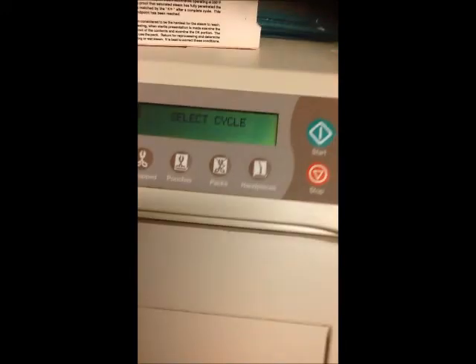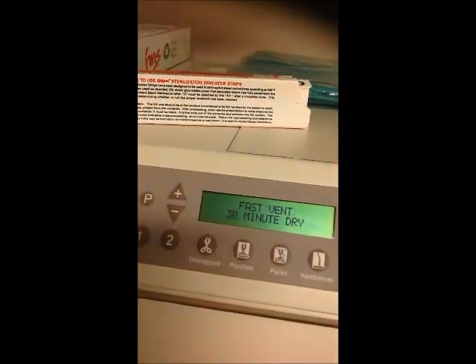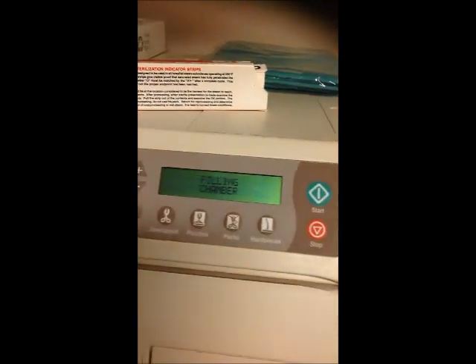There is a pack in there again, so I'm going to pick pack, 250 degrees for 30 minutes with a fast vent dry. I'm going to start.